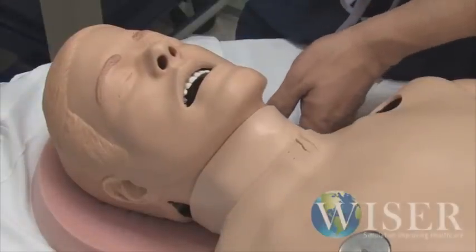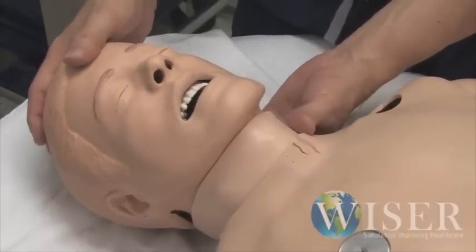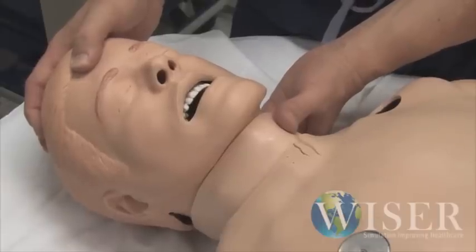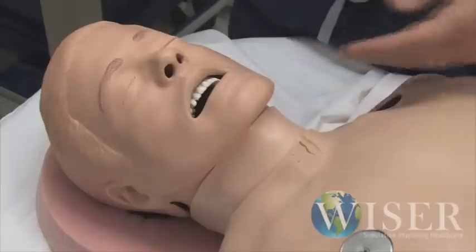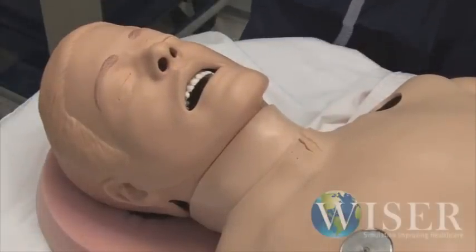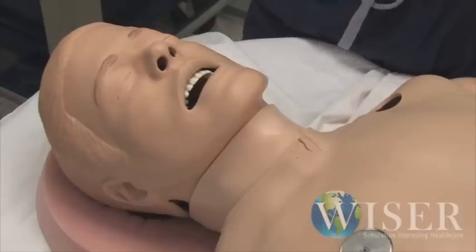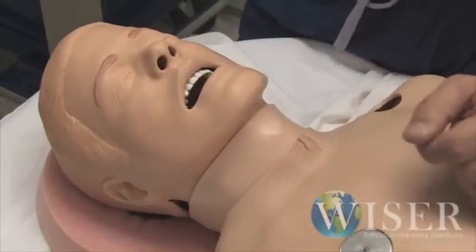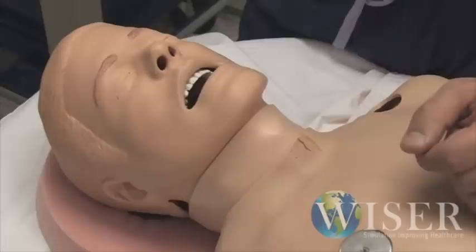We can also lock up his neck and decrease his cervical range of motion, so his neck can't really be extended. This could be used for a patient with a broken neck or a diabetic patient, or as a way to prevent direct laryngoscopy and force you to do something else. We can also give him pharyngeal obstruction — swallow his tongue — which could be consistent with anaphylaxis. He has malleable vocal cords that we can lock together, sending him into laryngospasm, which can simulate upper airway obstruction requiring an oral airway, or a case of laryngospasm.